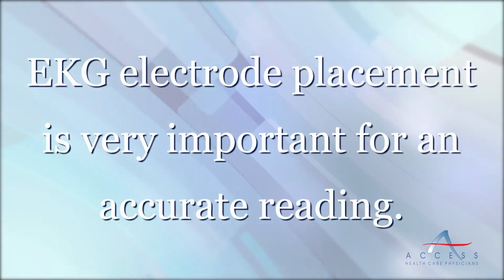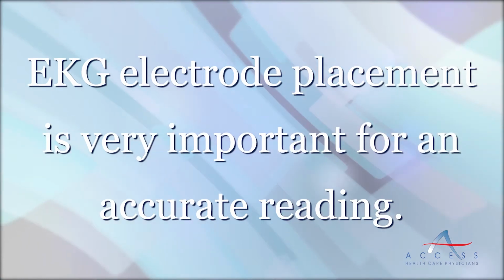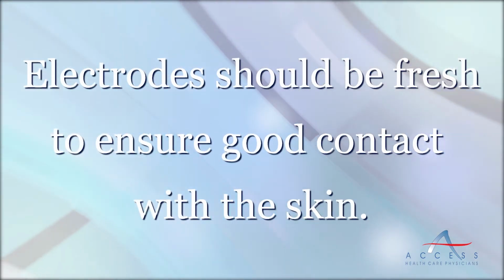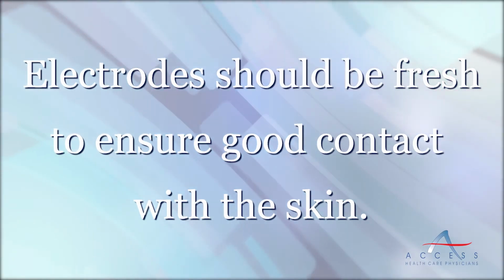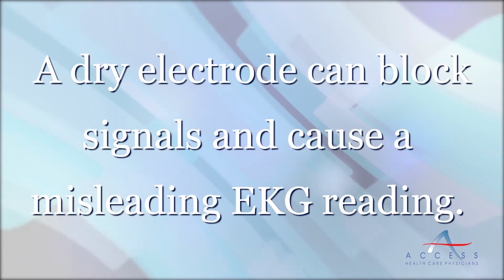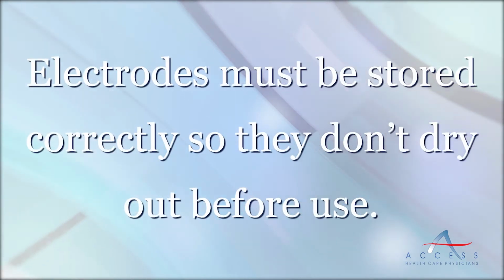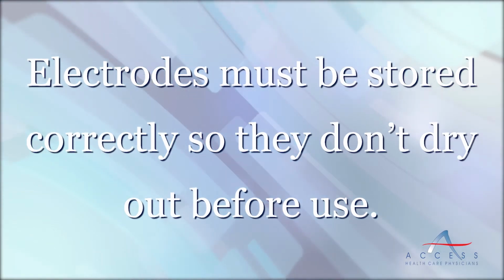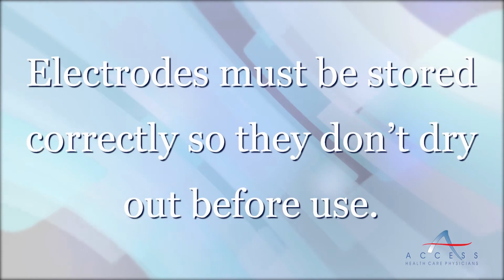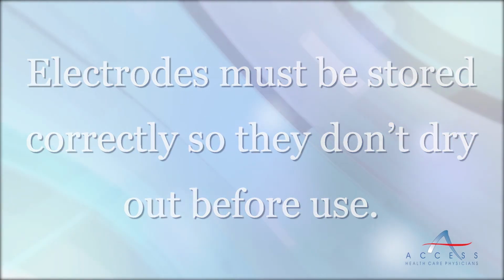Exact placement of each electrode on the patient is important. Incorrect placement can lead to a false or misleading diagnosis, so make sure the electrode conducting gel is fresh and adequately moist. A dry electrode with inadequate gel reduces the conduction of the EKG signal. Oftentimes, electrode gel dries out as a result of incorrect storage. Store electrodes as instructed by the manufacturer and do not remove them from their pouch until they're ready to use.